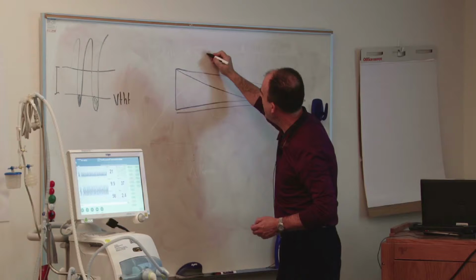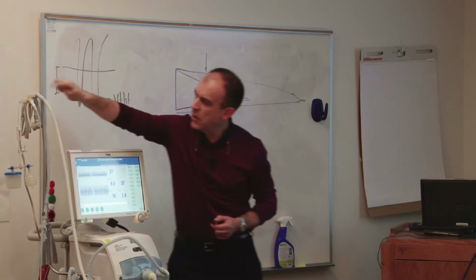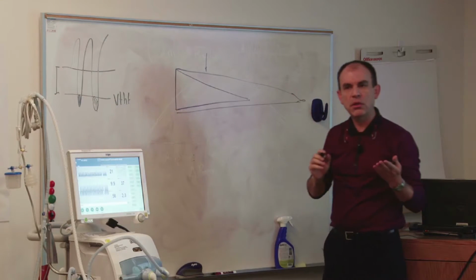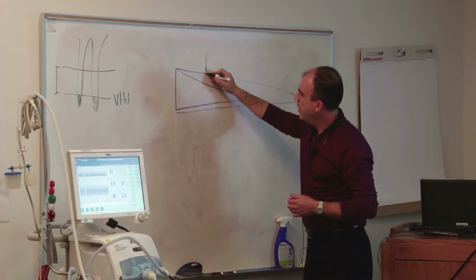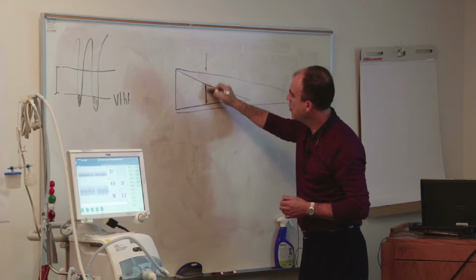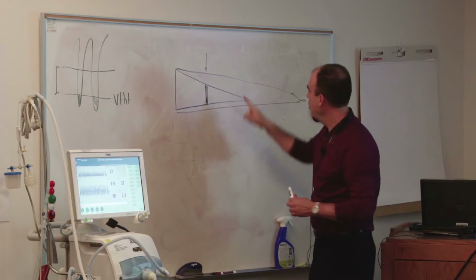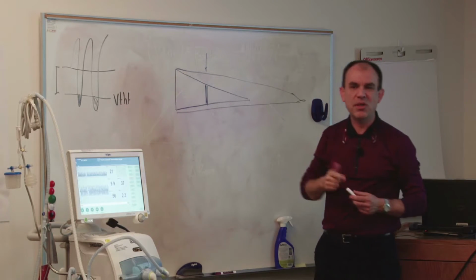Whereas here, we have a midpoint. And that midpoint is the flow sensor here. So it sounds logical to think that if we start getting a lower oscillation in that midpoint, that should correlate with less oscillation in the baby. And that's what we're starting to see.